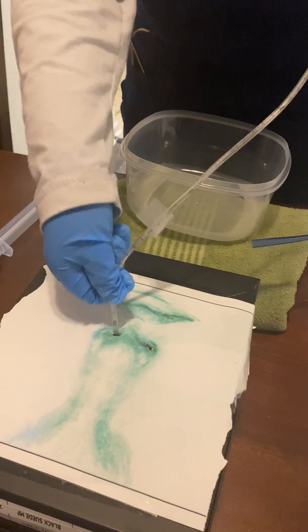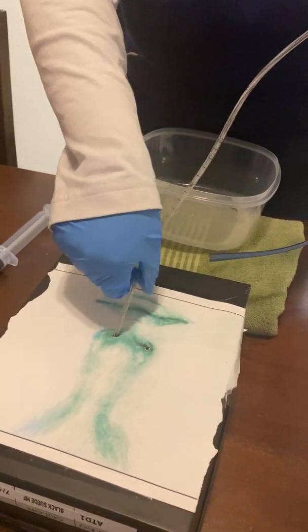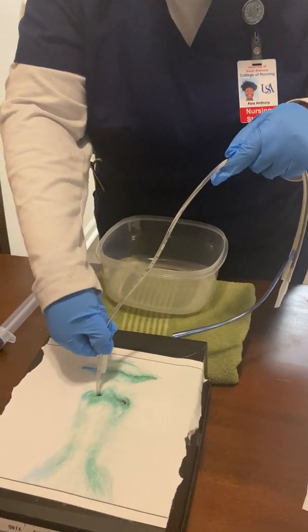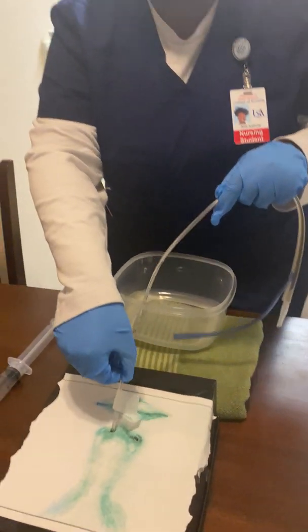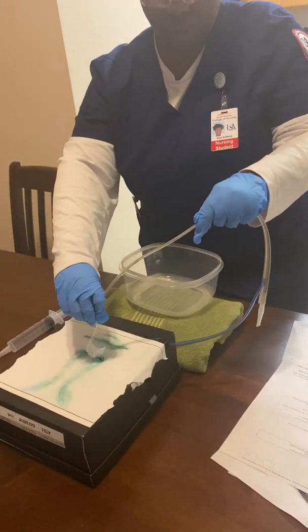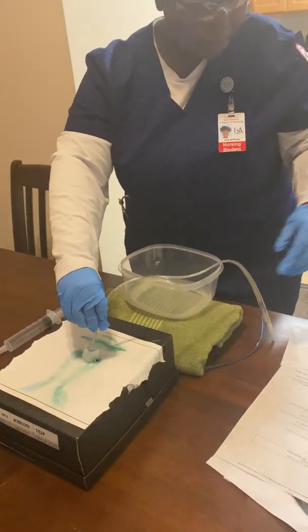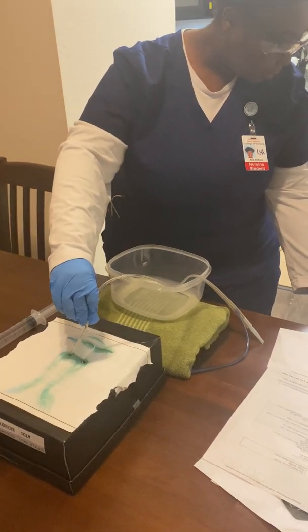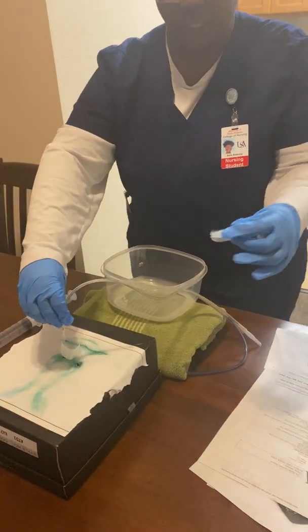And after they become stabilized, I will have them swallow again. So next, once I reach my placement, I am going to grab a piece of tape to secure against the cheek.